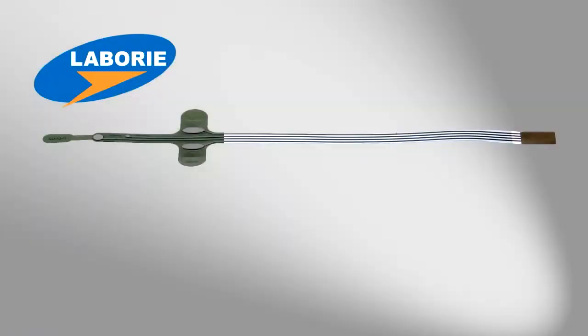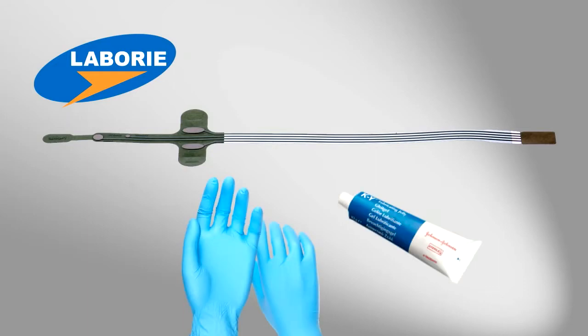Patient preparation is very simple because it's done immediately after the anorectomanometry, and so the patient will still be on their left side, and there's no other additional preparation that needs to be conducted. The test uses the St. Mark's electrode and gloves and lubricant. That is essentially all that is needed to conduct this test.